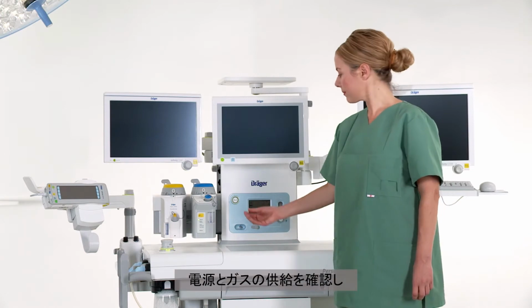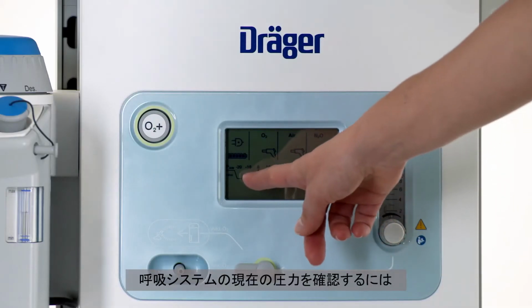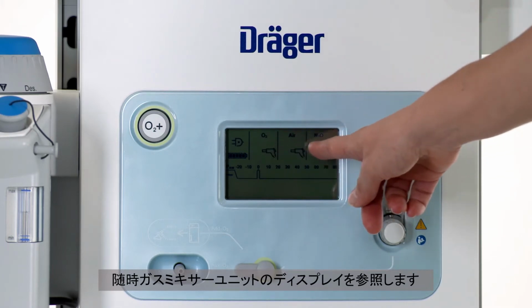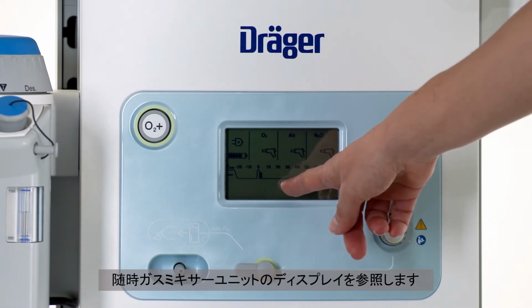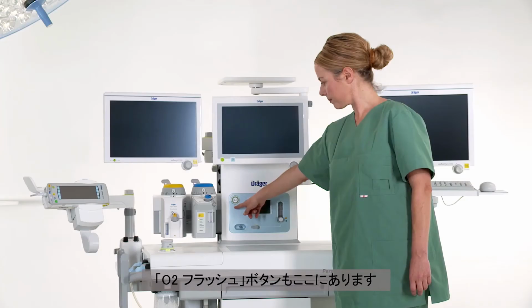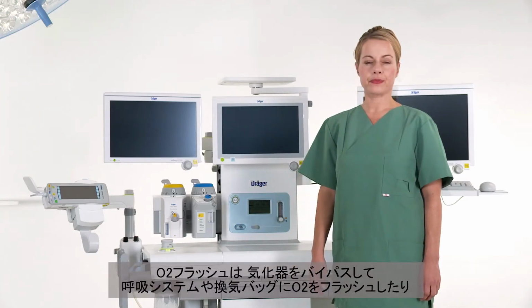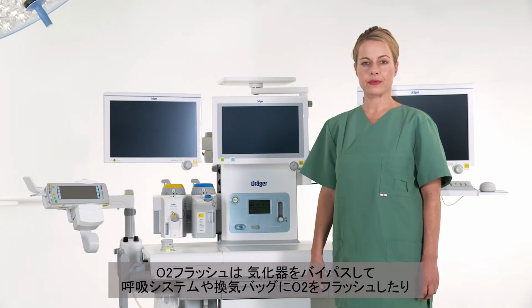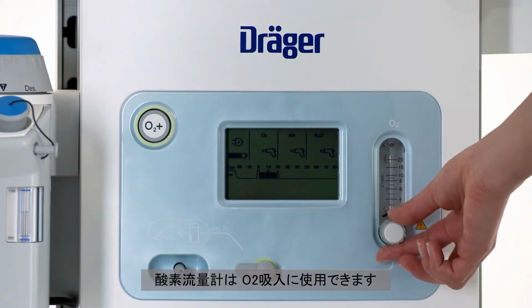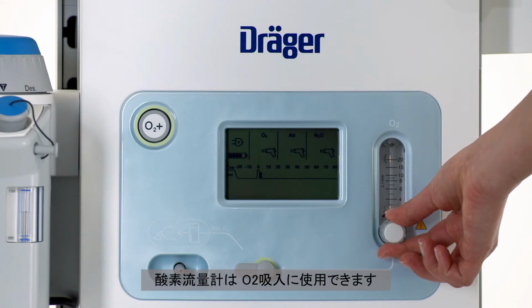To verify power and gas supply and to check the current pressure in the breathing system, you can refer to the display of the mixer unit at any time. This is also where you will find the O2 flush button. The O2 flush is used for flushing and rapidly filling the breathing system and the breathing bag with 100% oxygen, bypassing the anaesthetic vaporizer. The O2 flow tube can be used for oxygen insufflation.